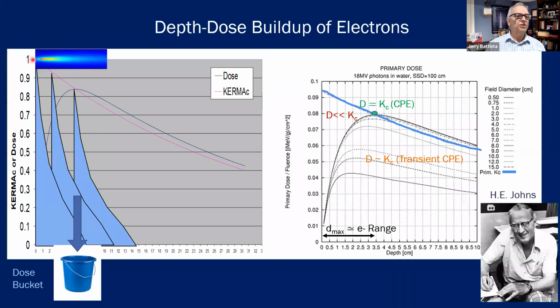But at each location, we have the release of electron energy, and I just made a rough sketch of what that might look like. So that's the electron pattern downstream. And then every point on here releases one, sometimes at less intensity because of photon attenuation, and another, all the way down.